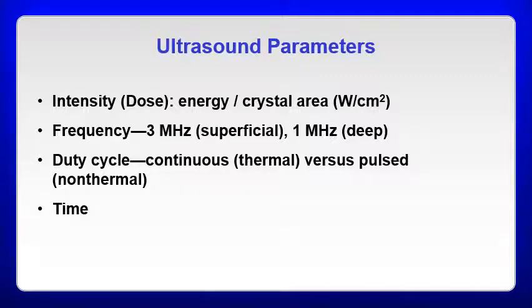And then your time, you'll be looking at based upon, again, what your goals are, particularly when you're looking at thermal treatments. We'll talk about time related to pulse treatments. Where time gets to be quite variable is when you're looking at thermal treatments. The reason for that is your time is going to be based upon how much of a tissue temperature increase you're trying to get. And we'll go through the procedure for how you select that as you're going through the ultrasound parameters.